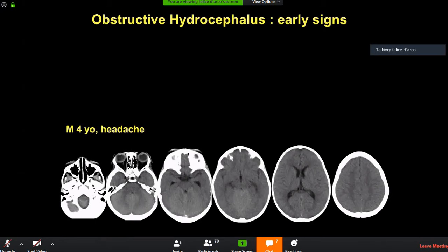If you have any doubt, check everything else — cortical veins, the rest of the veins, and the arteries. In the infant, the rest of the veins are not visible, so the hyperdensity is limited to the area of the thrombus. Remember: age is critical, and this is a well-known pitfall in pediatric neuroradiology.